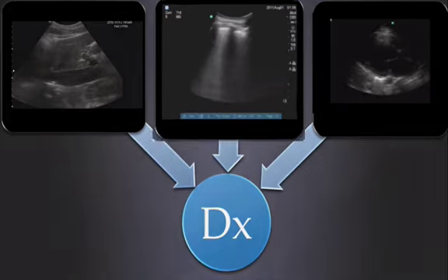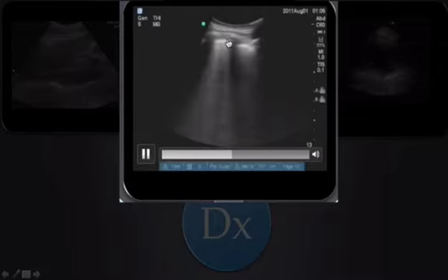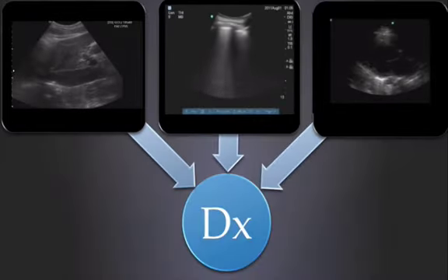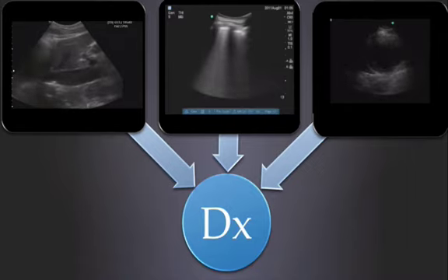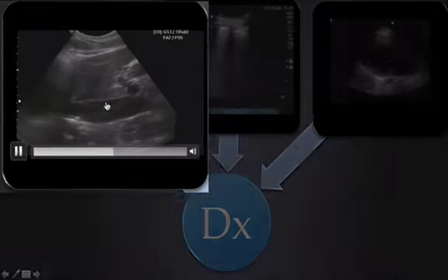So if we start off in the center, we have lung rockets, meaning they have fluid in their alveoli. This is at the bases, and as we move up their back, it gets less. We think, well, that sounds like a pulmonary pattern for congestive heart failure. What else would go with congestive heart failure? Elevated CVP. So we look at their IVC. Here's their IVC. It's very dilated. It's not collapsing with respiration. Therefore, their central venous pressure is high.